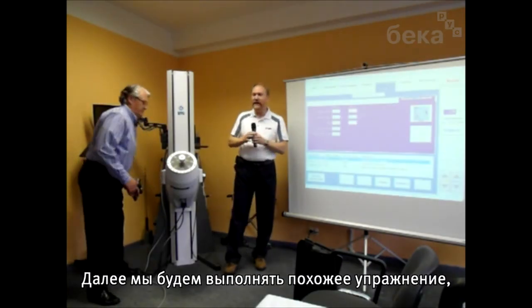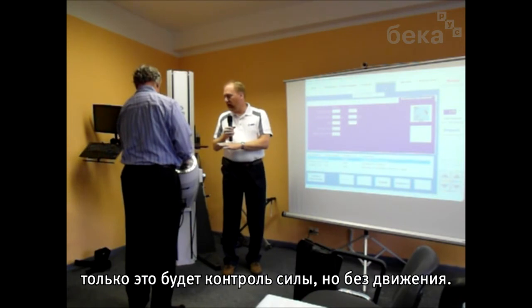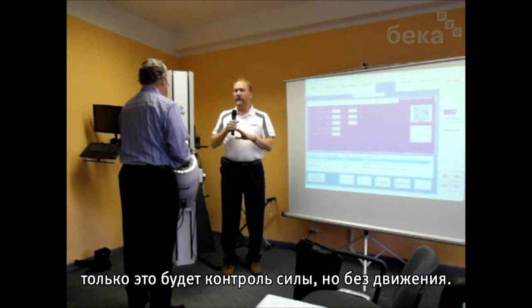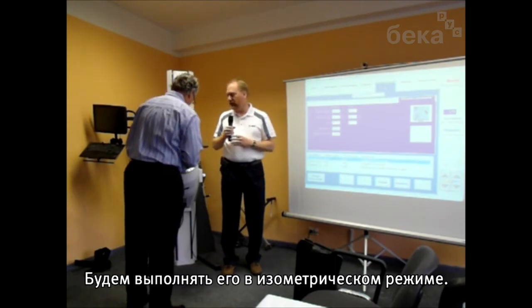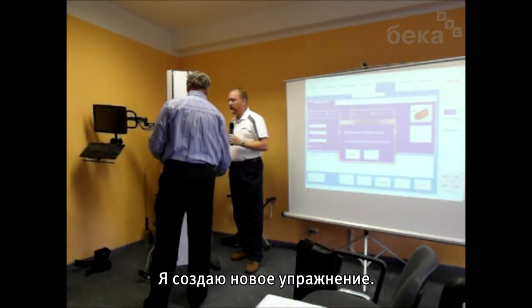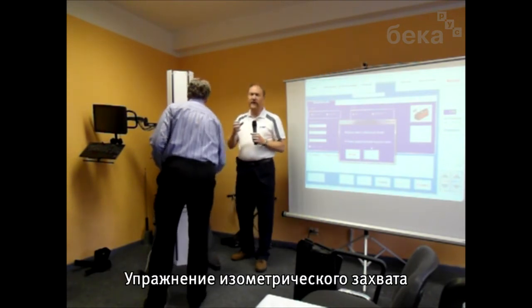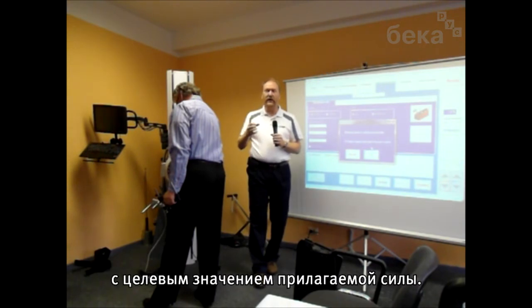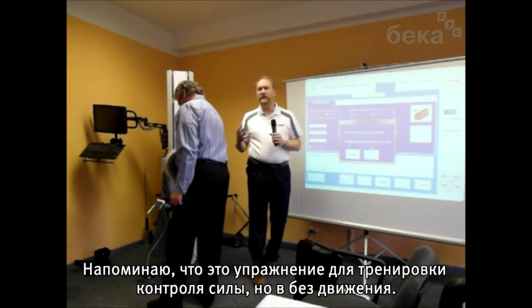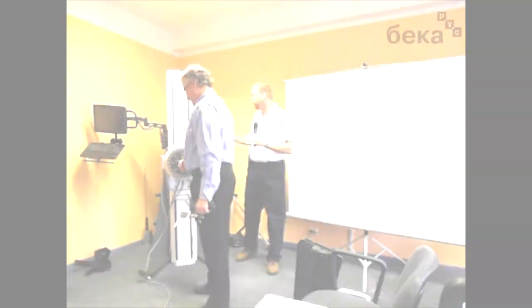So what we're going to do next is a similar type of exercise to what we just did, except it's going to be force control output, but with no motion. So we're going to do it in the isometric mode. So I'm going to create a new exercise to do an isometric grip exercise with a target force, again, to help teach force control output, but it's going to be with no motion this time.